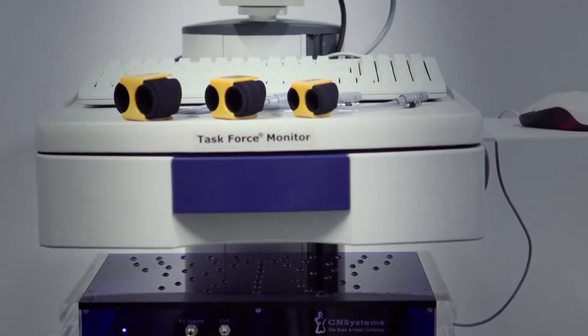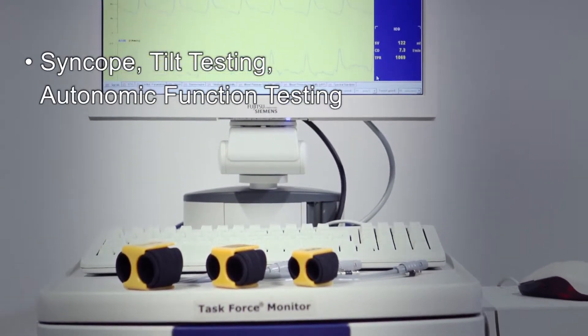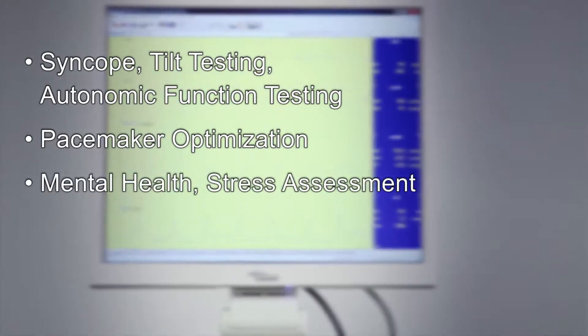The device is often used for testing of syncope, orthostatic hypotension, autonomic function, optimization of biventricular pacemakers, and applications in mental health.